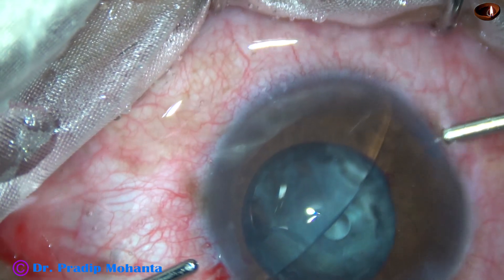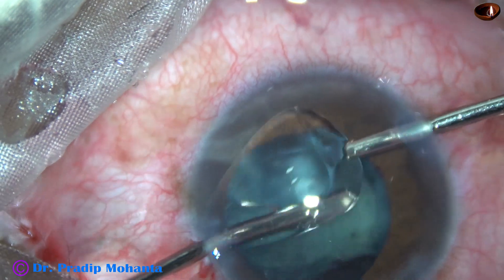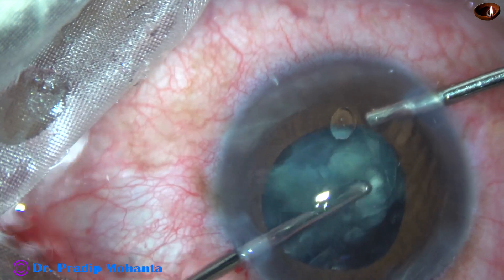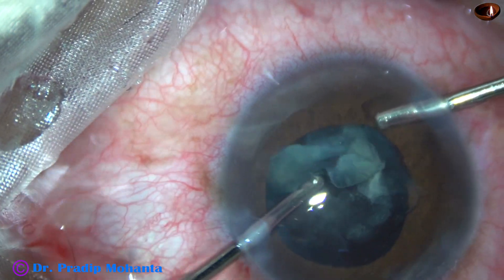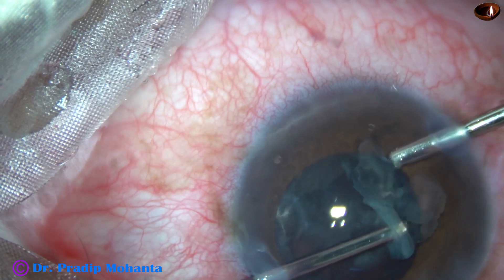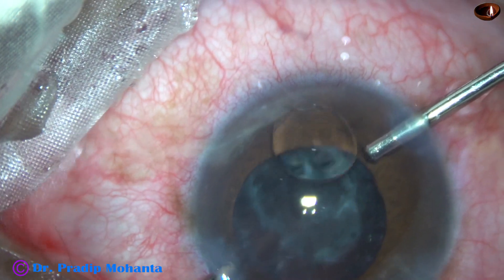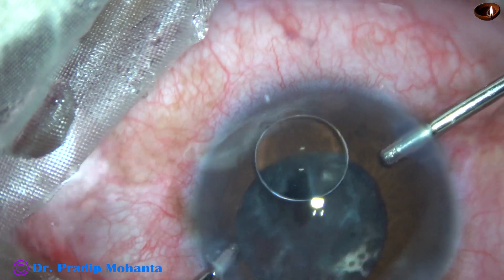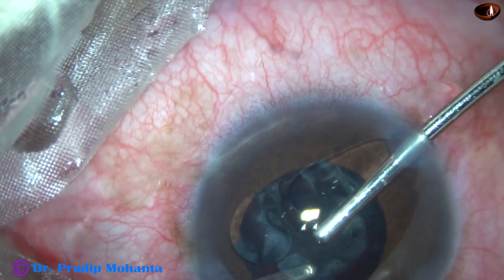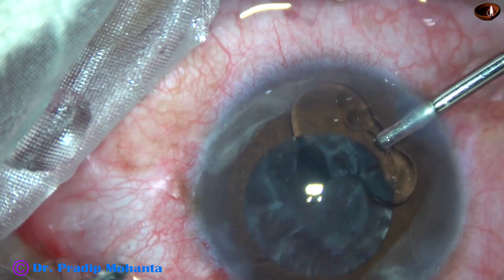Now I am going to use bimanual irrigation-aspiration for removal of the cortex. When there is silicon oil in the vitreous cavity, we need not worry about dropping some lens matter — it will not drop. A lot of silicon oil is coming into the anterior chamber.